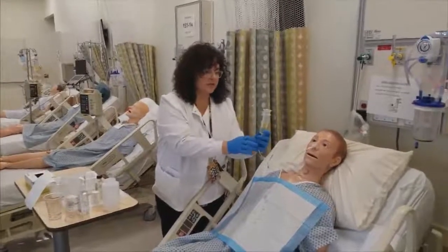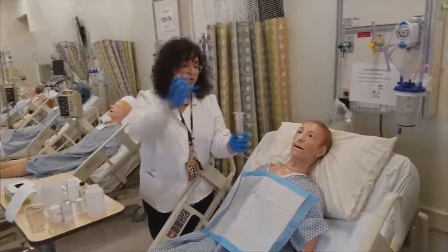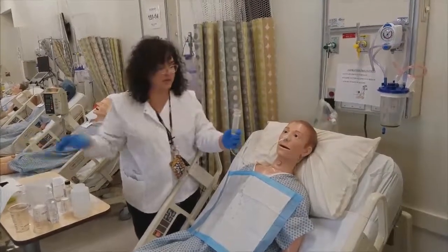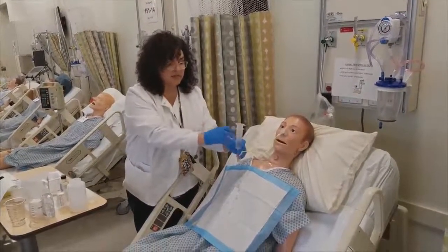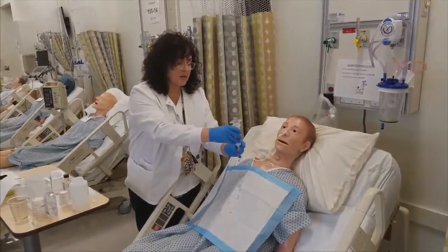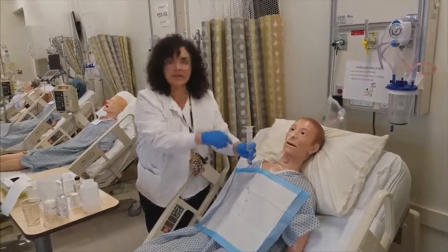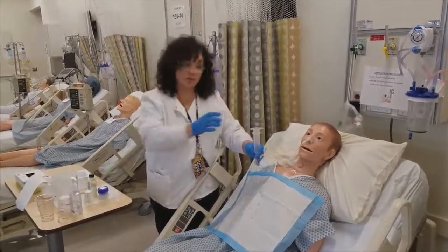Lactulose in the clinical setting is pretty thick, so we could always add a little water to it, or at any point if we need to use our plunger to help it go down, we can do that too. Okay, now it's in the tip. This was my last medicine, and because as I said, it was pretty thick, the lactulose, my post flush is between 30 to 60.